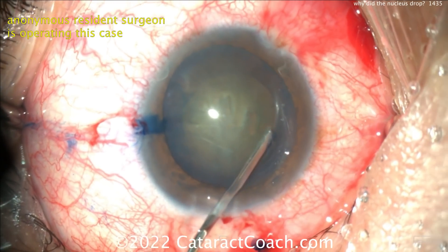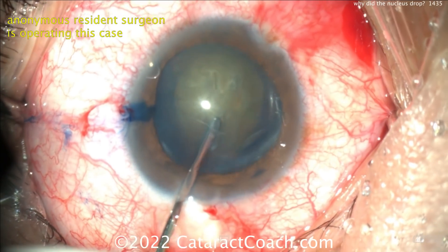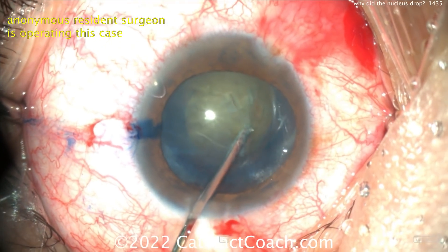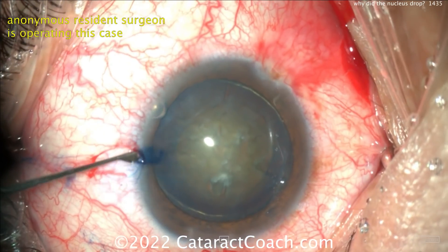A little bit of hydrodissection — hard to see the fluid wave because the lens is pretty opaque. It looks reasonable. Let's see, does it spin? Whoa! Look at that gap being created there sub-incisionally. That's called weakening the zonular support — a tremendous amount of it.